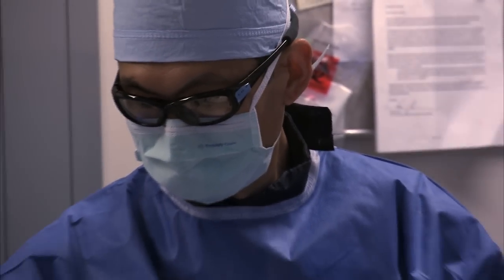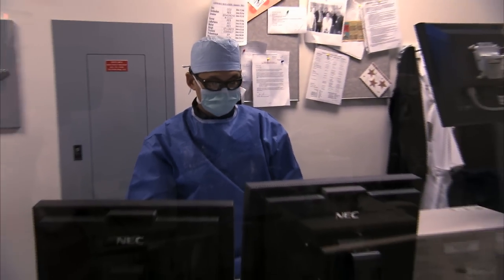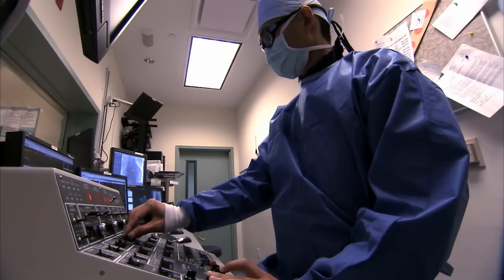Ventricular tachycardia catheter ablation is a very important tool in the management of this rhythm problem because it allows us to actually find the problem and eliminate the focus that is causing the rhythm disturbance, and many times really help in controlling someone's rhythm alongside things like the medications or the implantable devices. Today, in this video, I would like to explain how catheter ablation is used to treat ventricular tachycardia. Let me explain by looking at the normal heart rhythm for a minute.